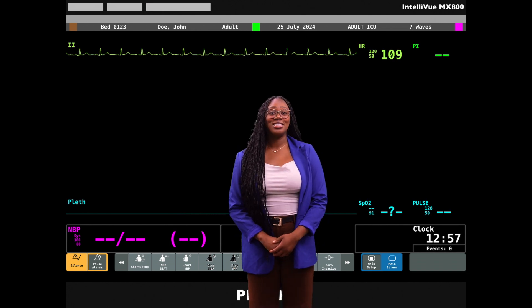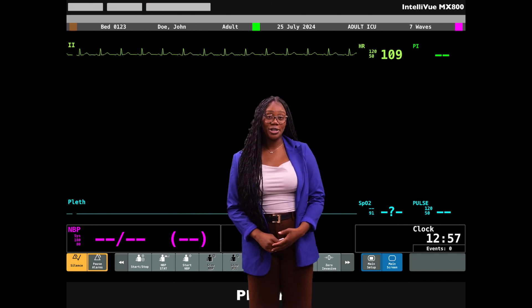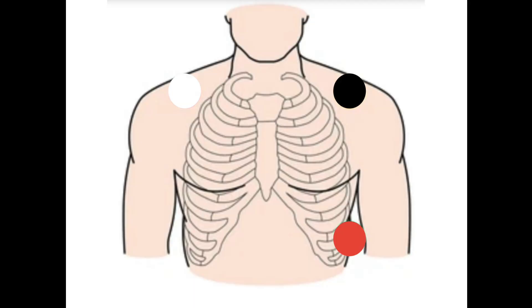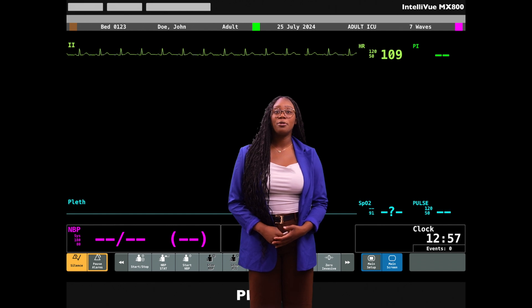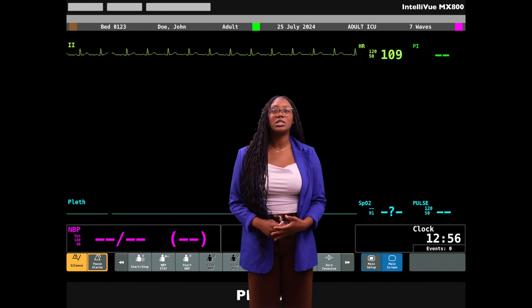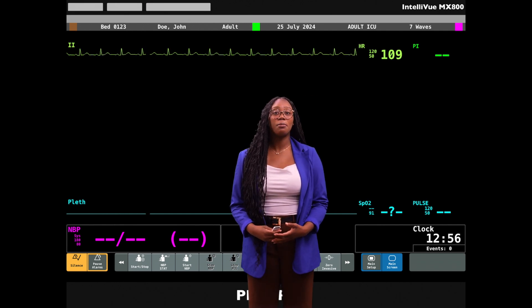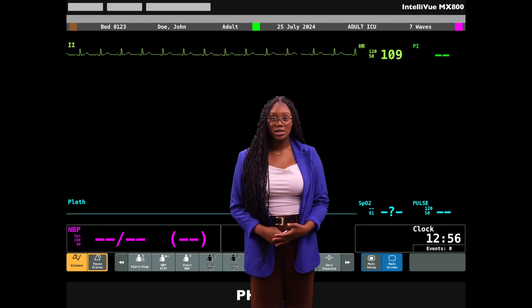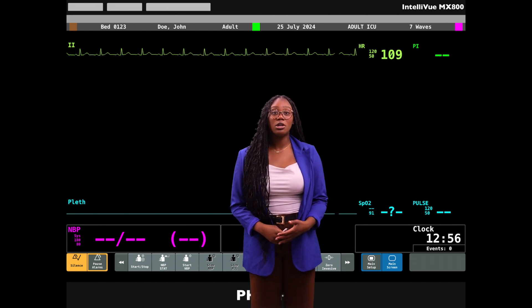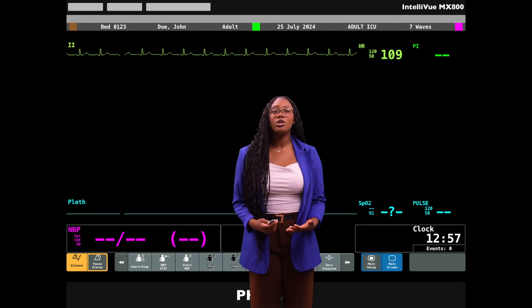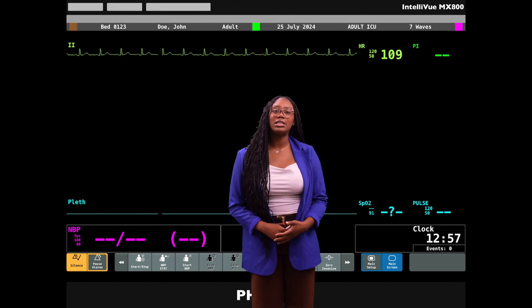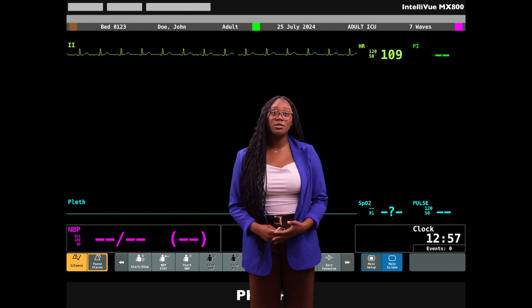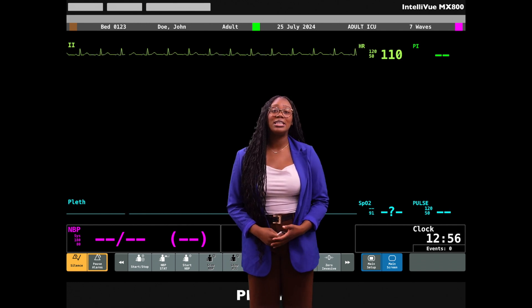Proper lead placement is crucial to reading a patient's heart rate correctly. You can use the mnemonic 'white on right, smoke over fire.' In a standard three-lead setup, lead two is the most commonly used for continuous cardiac monitoring because it gives a good view of the electrical activity of the heart. If lead two is not helpful for monitoring heart rate, you can switch to another lead. Abnormalities should be confirmed with a 12-lead EKG.